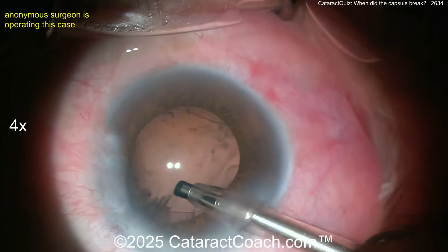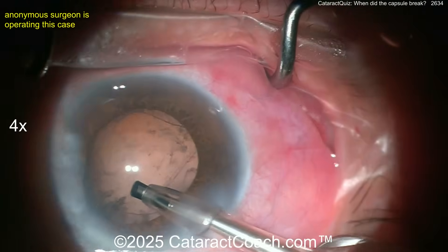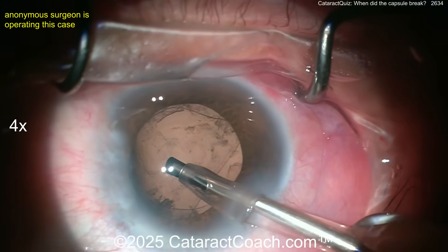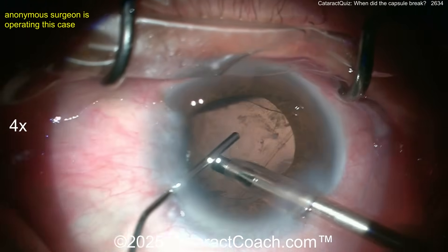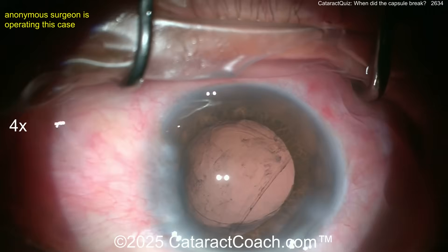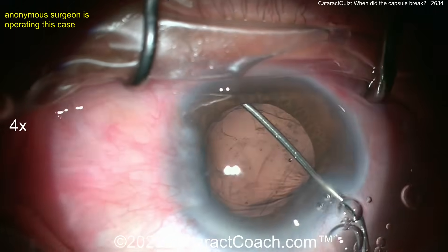The anterior capsule rim looks like it split and ran backwards — at about the one o'clock position in your view. Don't come out of the eye; don't let the eye deflate. Get the viscoelastic in there. The anterior capsule rim broke and split all the way to the posterior capsule — at about 1 to 1:30 — through the anterior capsule, running all the way back to the posterior.